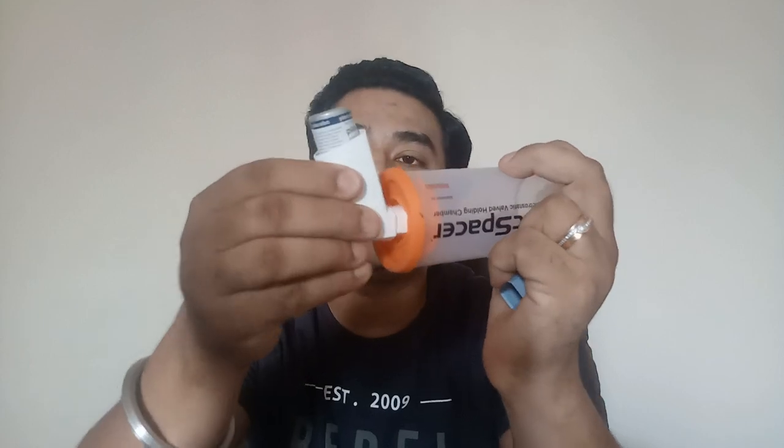And this is a MACSPACER. This is a spacer which goes by the name MACSPACER. This is the mouthpiece. You have to open it like this. And here is the back piece where the metered dose inhaler fits. So now coming to how to use this. First, you take the inhaler and insert it here in the back of this. Then this is now ready to use.